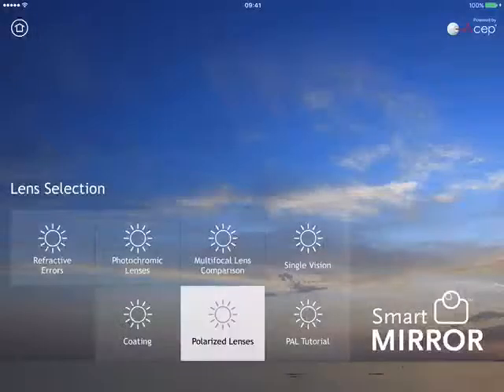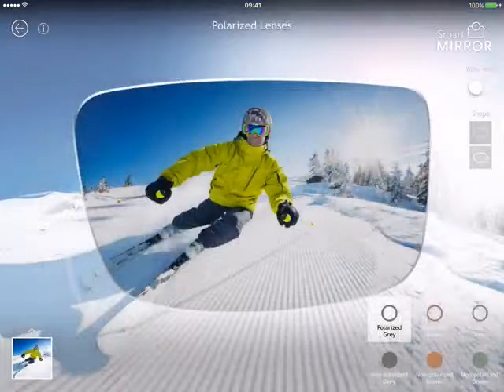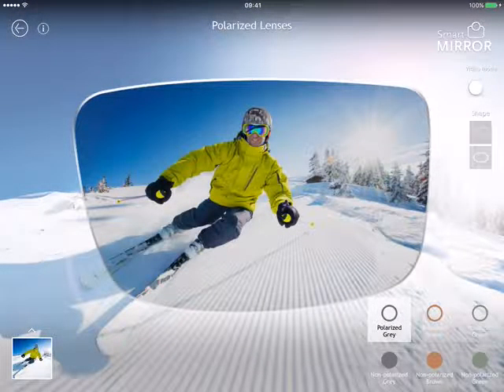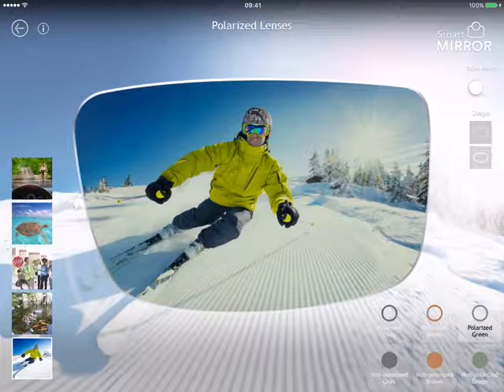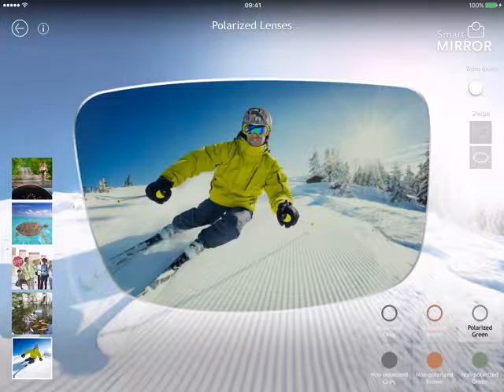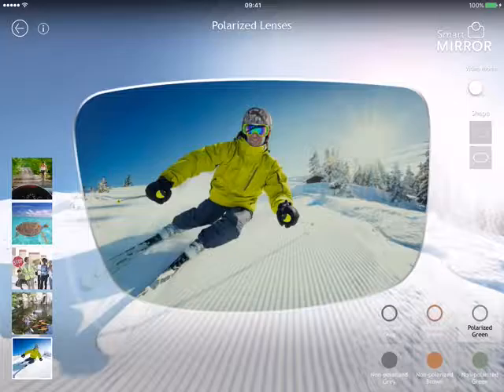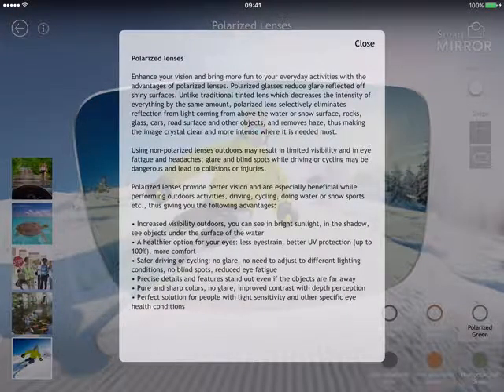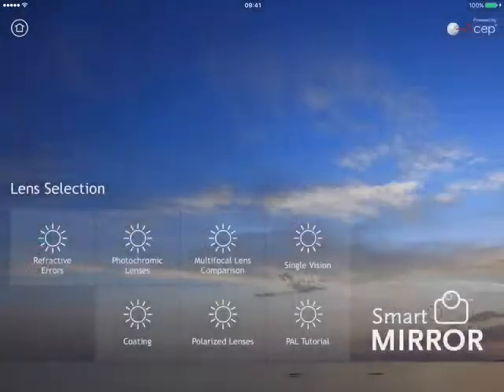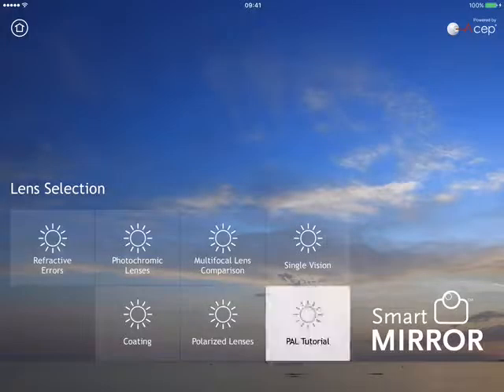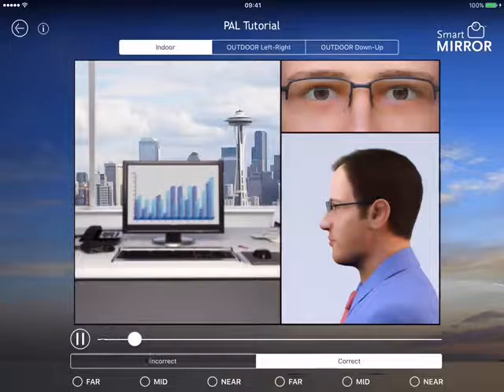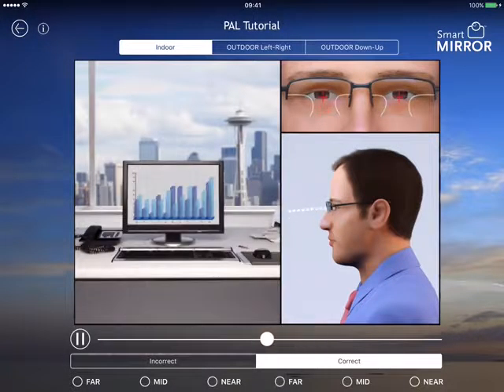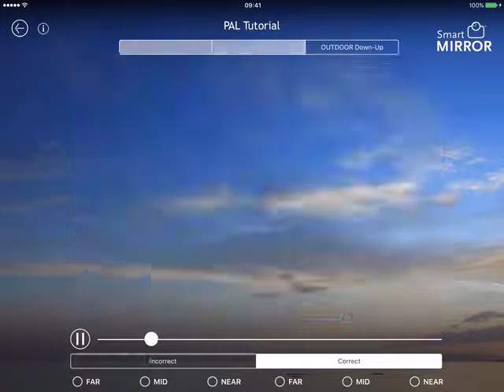For polarized lenses — grey, brown, and green — and non-polarized, with two images and lens shapes, you can run it in image and video mode, again with an info section. For the PAL tutorial, this is for progressive lens wearers — specifically first time progressive lens wearers — to show them the right way and the incorrect way to use progressives in indoor and outdoor settings.